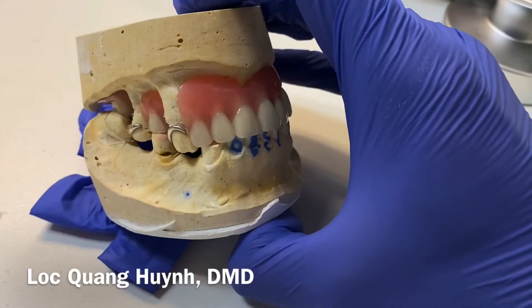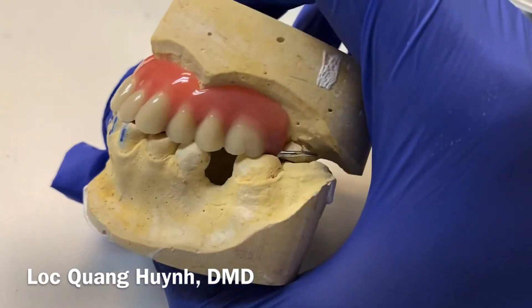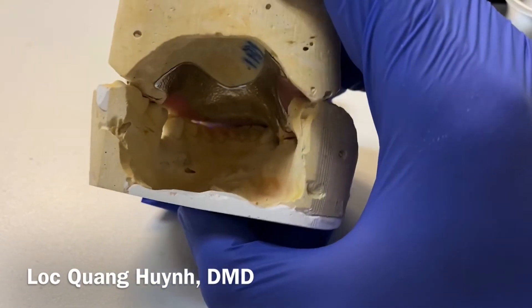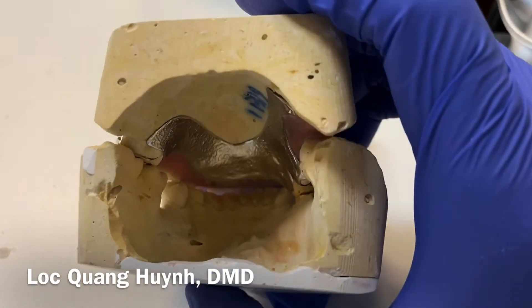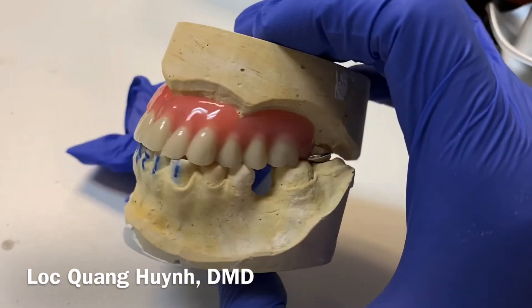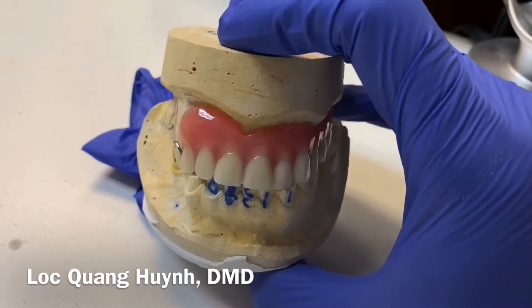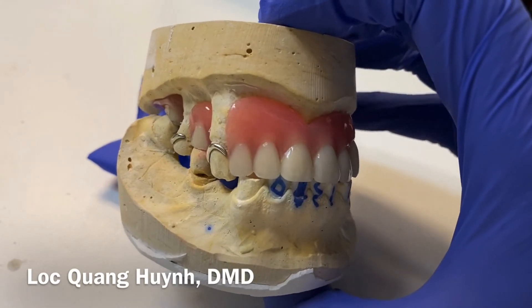Anyway, this is just to show you how dentists can give you a partial denture. Here in the back is how it looks — imagine you are looking through the tongue side, okay, tongue side — and this is how it looks for the patient.